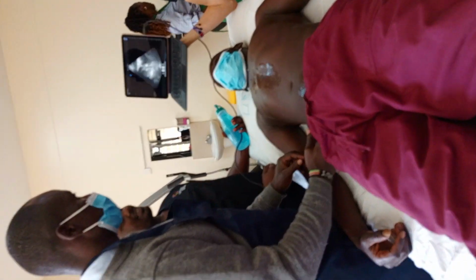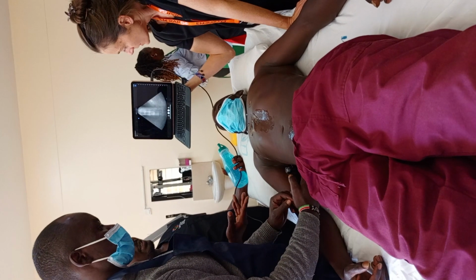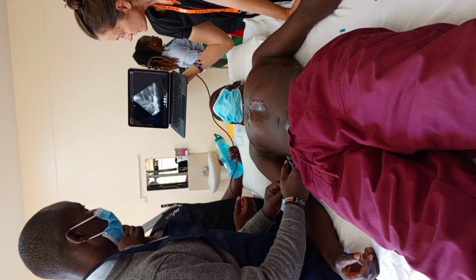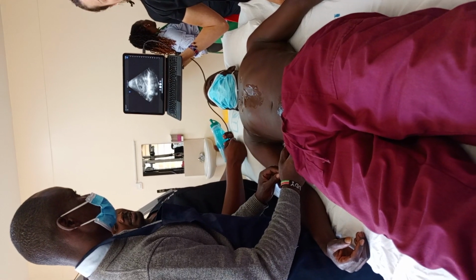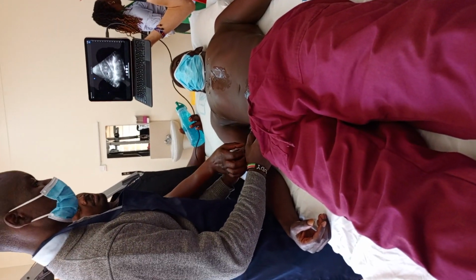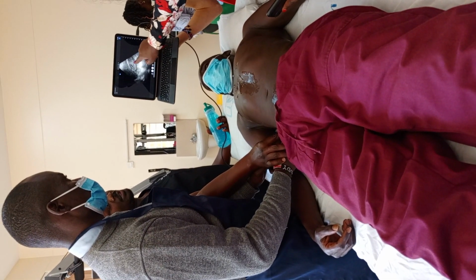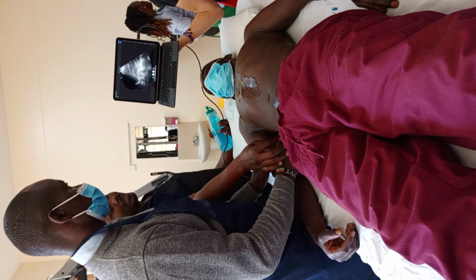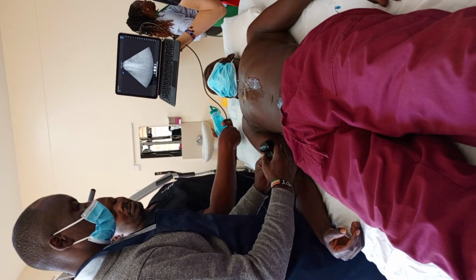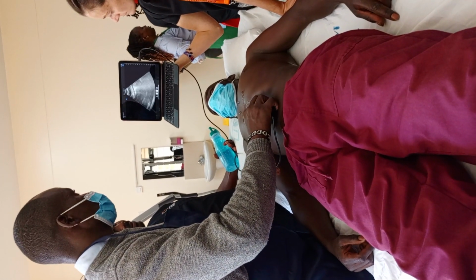All right. Please tell me this patient was hit by a car and he has so much abdominal pain. You're doing good. You got liver, fine kidney. Beautiful. Monica, where's the kidney? That's liver. Yep. Morrison's pouch. Yeah, that's that potential space. Gorgeous. Okay, no problem.